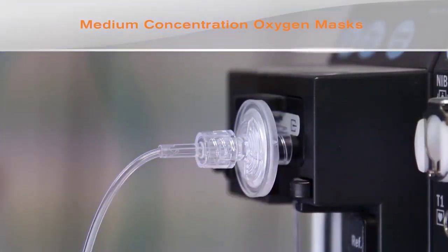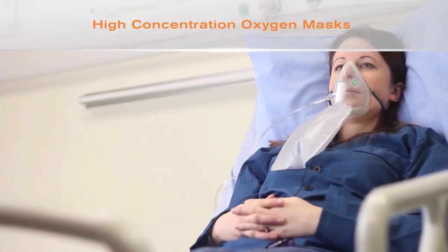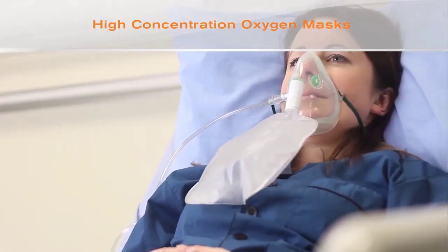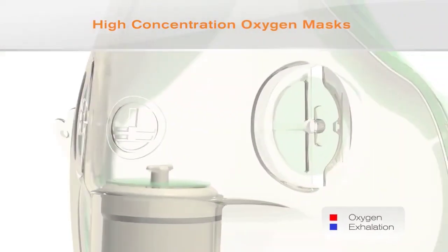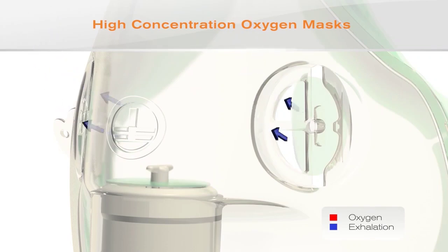to a capnograph. The final variable concentration oxygen mask we are looking at is the high concentration mask, also known as the non-rebreathing mask, and is usually used when high concentrations of oxygen are required, for example with the critically ill or unstable patient. The patient breathes from the mask and the inspiratory valve opens so that oxygen is taken from the reservoir bag. The patient breathes out through the expiratory valve.